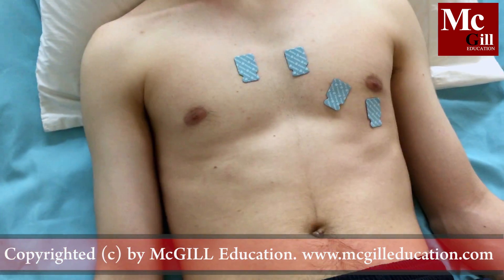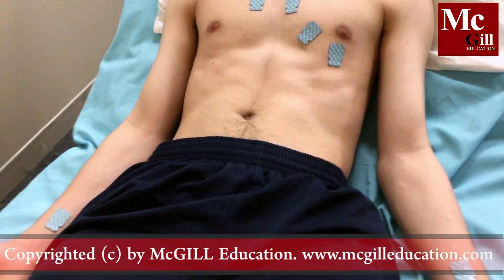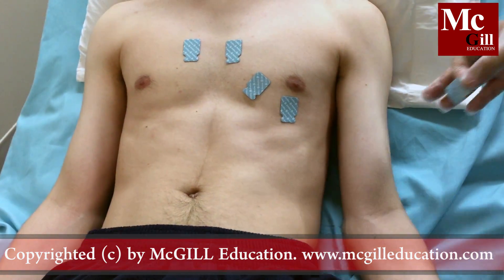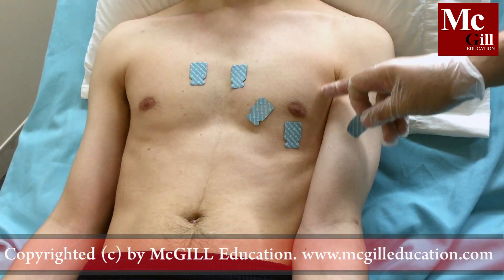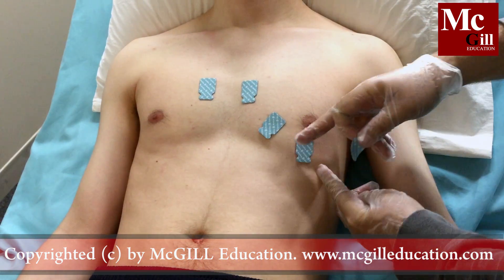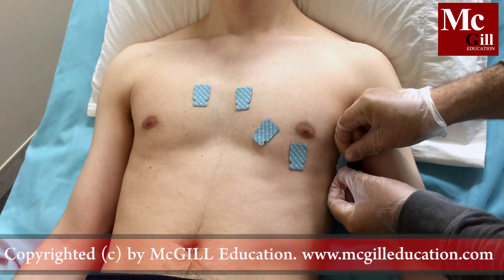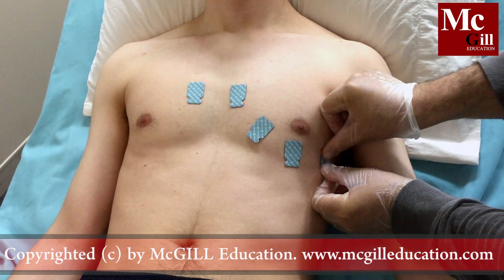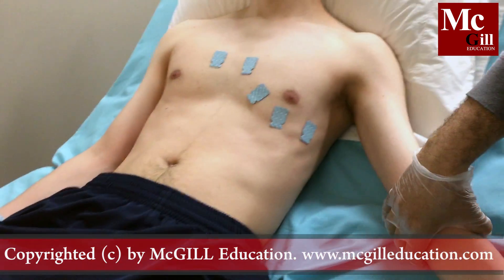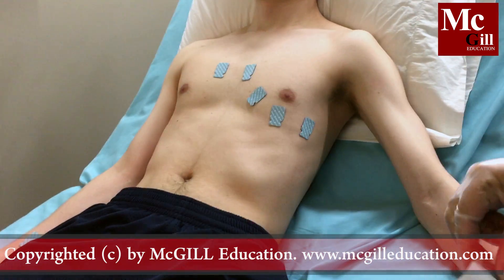Position the V5 electrode in the left anterior axillary line, which is also in line with V4. Position the V6 electrode in the left mid-axillary line, in line with V5.